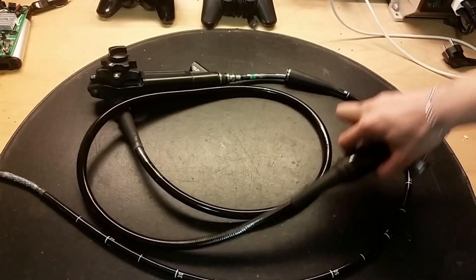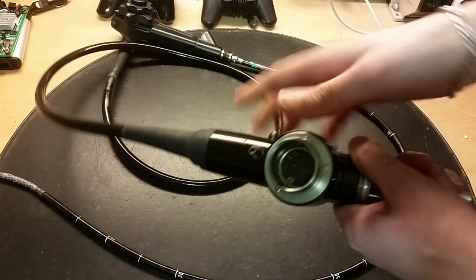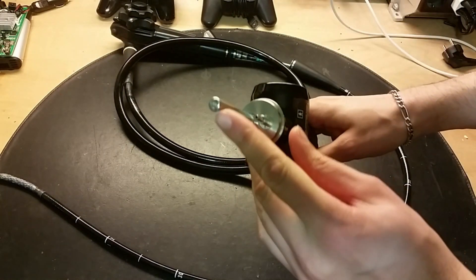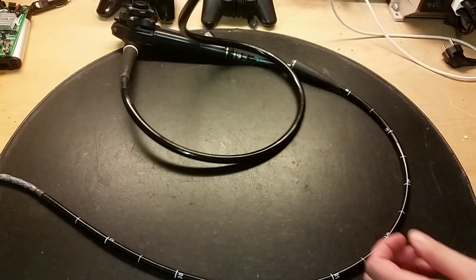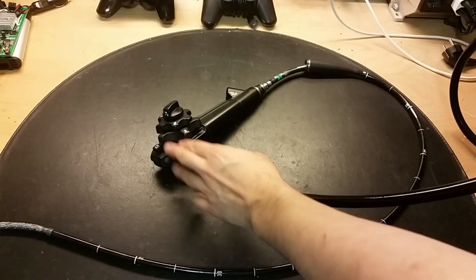This endoscope has two parts. This part here is connected to the supply and we've got some power pins here. Here we've got the light source, and here's a pipe that you can put some air or water into it. This one cable goes to the other part which is here.